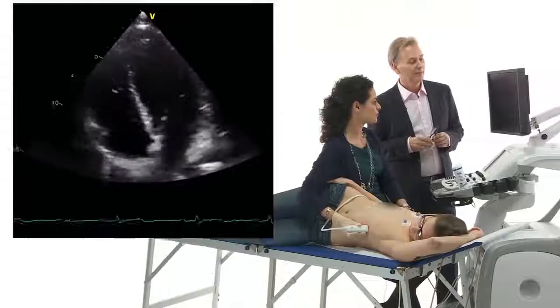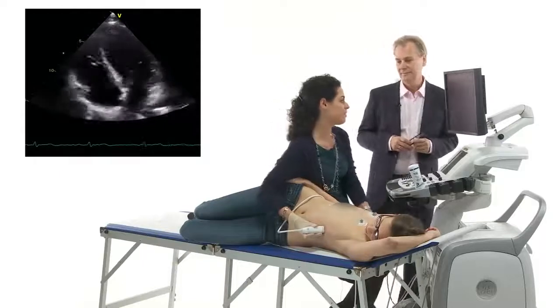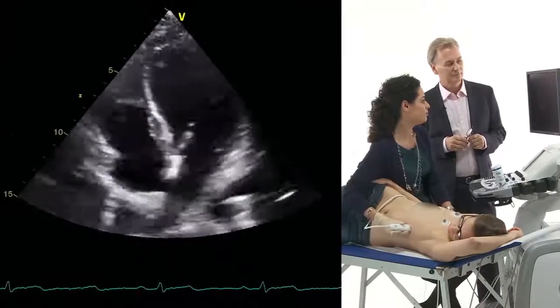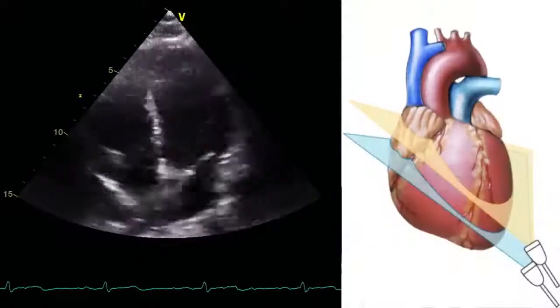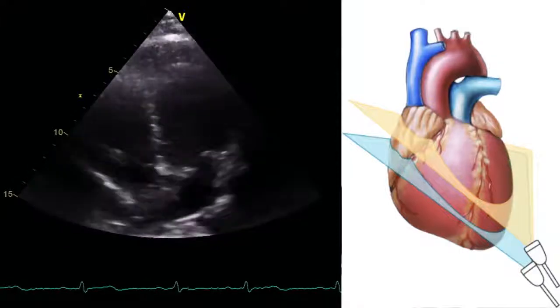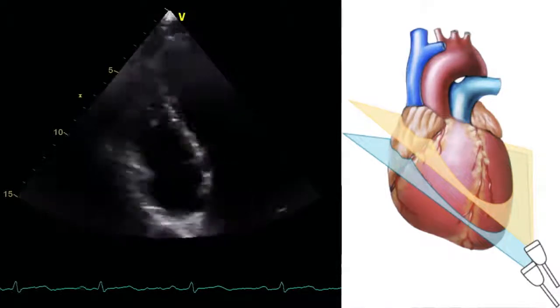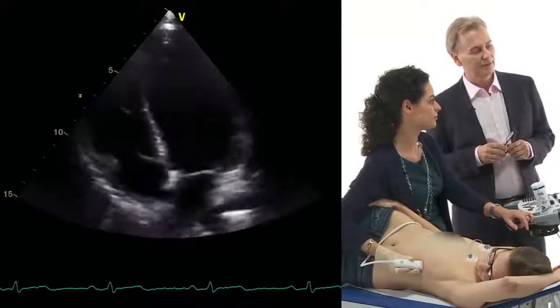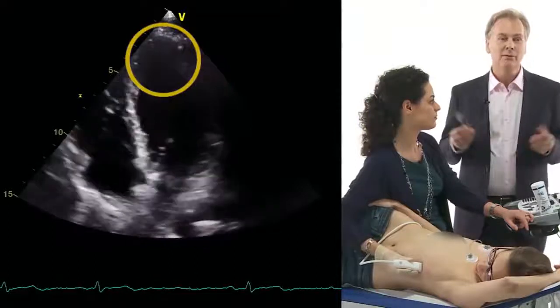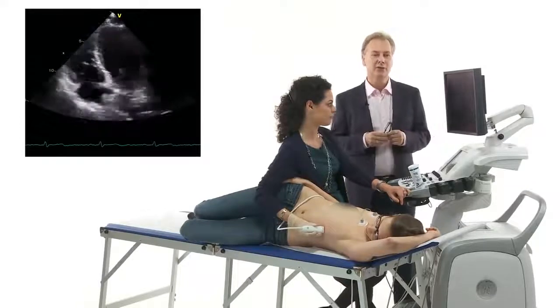You also have the valves but that will come later. But not always do you get such perfect images. What can also go wrong? The most common thing is to have not a good picture of the heart and to shorten the ventricle. This is called foreshortening and it's due to the movement of the probe more cranially. The only thing you need to do is move it caudally to get a better view. This is important because if you foreshorten the ventricle you don't see all the apical segments. But if you want to look at the global left ventricle function it's sufficient even if you only have a foreshortened chamber view.